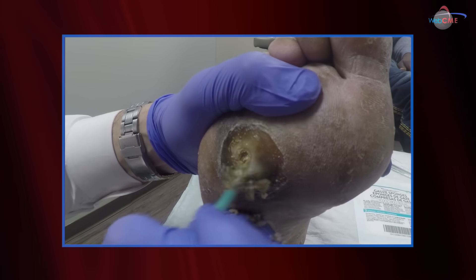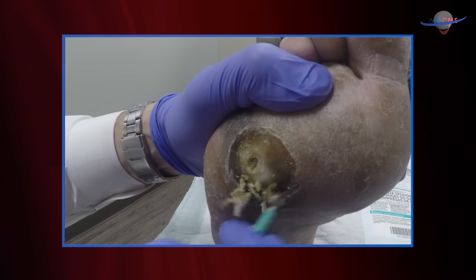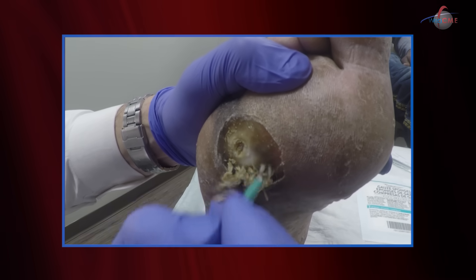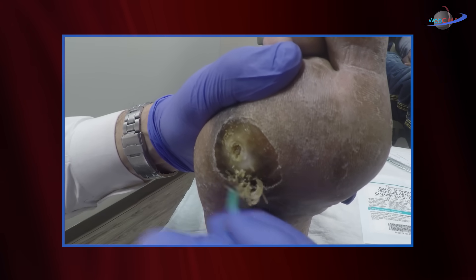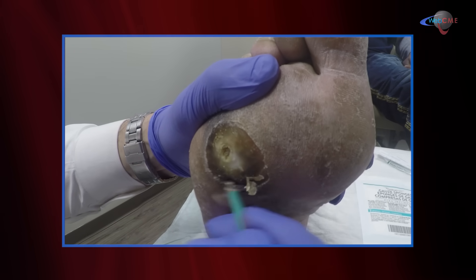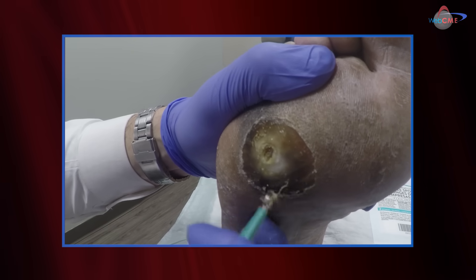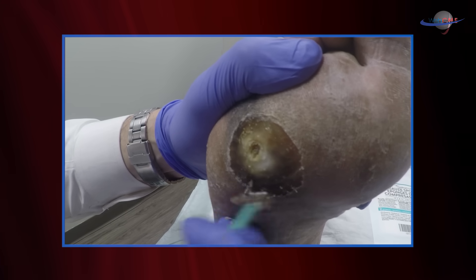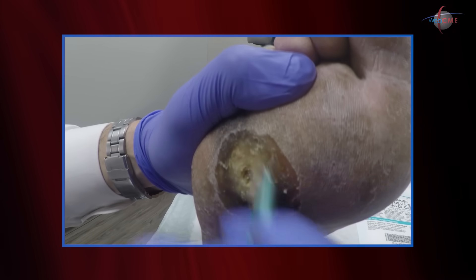Diabetics not only have neuropathy but calluses that are fairly insensate, so typically you're not too worried about pain that might otherwise be associated with a debridement. Pain is always a consideration, but I always ask patients to tell me if I'm hurting them — when I'm debriding I'm not looking at their face, I can't monitor the pain myself. Our patient here is showing us that he is not feeling this to any significant degree. You might ask yourself: how do I know when I've done enough debridement into the callus?